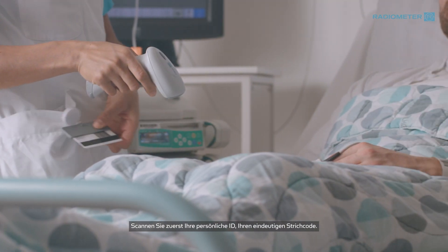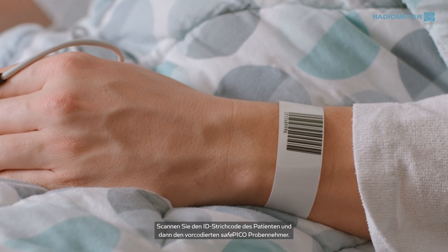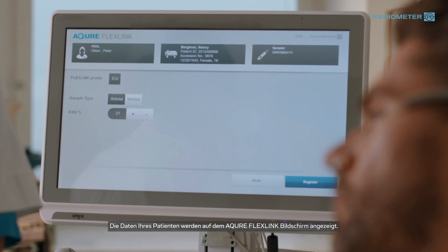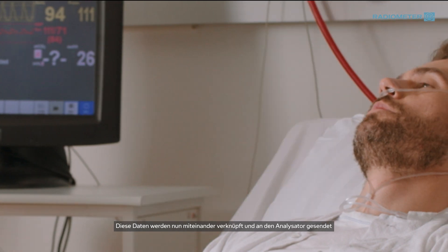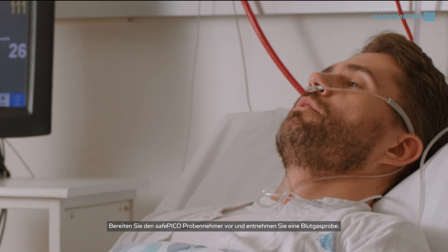Start by scanning your personal ID, your unique barcode. Scan the patient's ID barcode, and then the pre-barcoded SafePico syringe. Your patient's demographics are displayed on the Acure FlexLink screen. These data are now linked together and sent to the analyzer. Prepare the SafePico syringe and collect a blood gas sample.